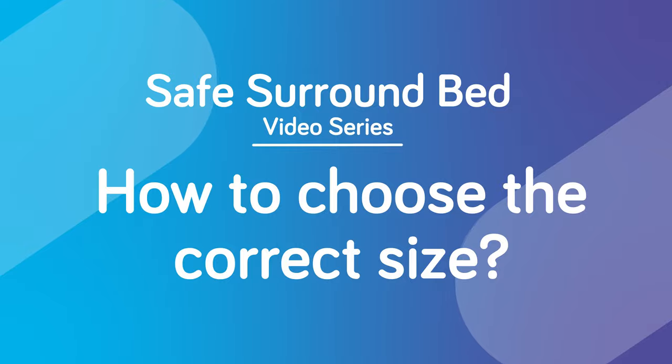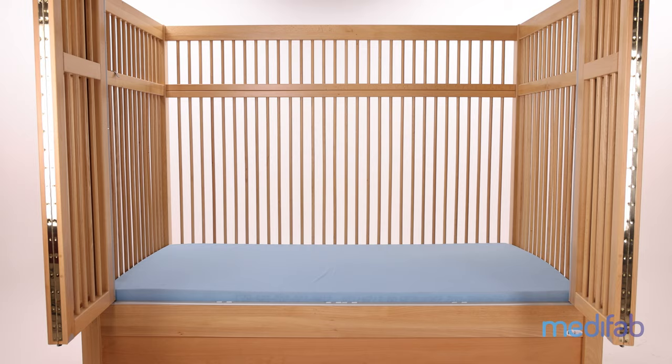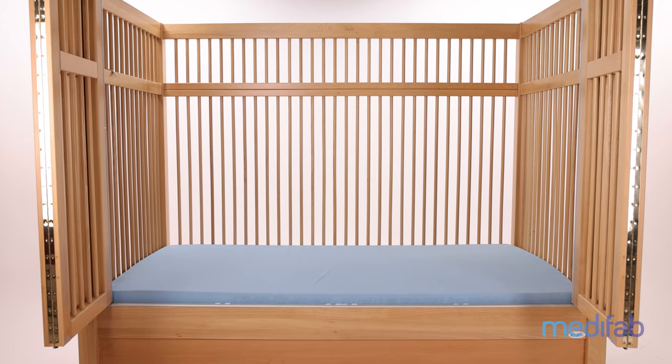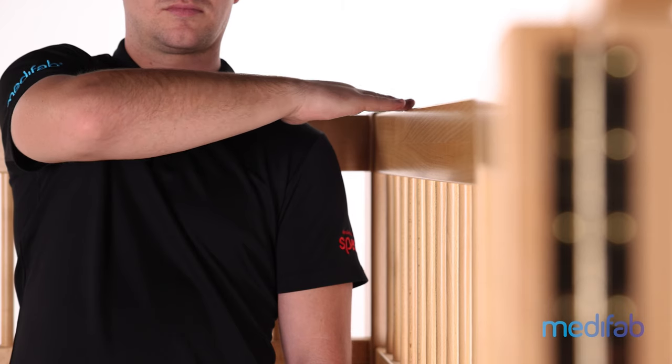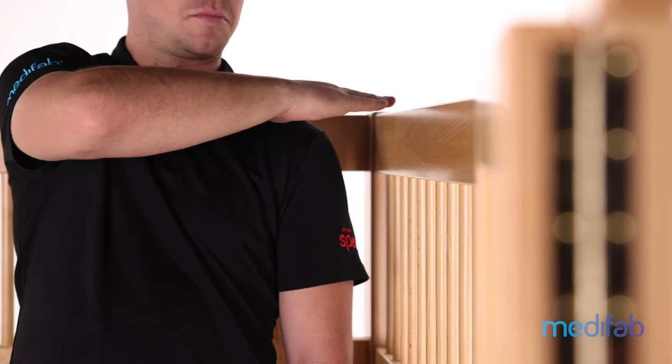The Safe Surround beds come in two sizes: 135 centimeter and 170 centimeter versions — this refers to the height of the sides. The one you see in this video is the Safe Surround 135. For many users, 135 centimeters is plenty, as they may not have the strength to pull themselves up and out of the bed. The 170 centimeter version, however, is very tall and suits the highest level of behavioral needs. For example, I stand 174 centimeters tall, and when I stand in the bed, the top comes to my shoulder height.